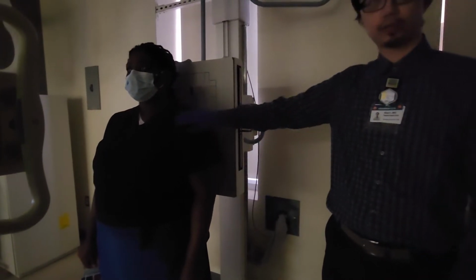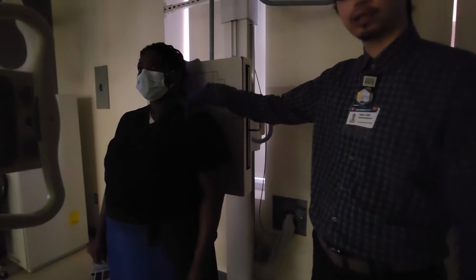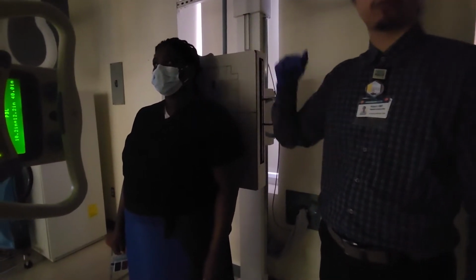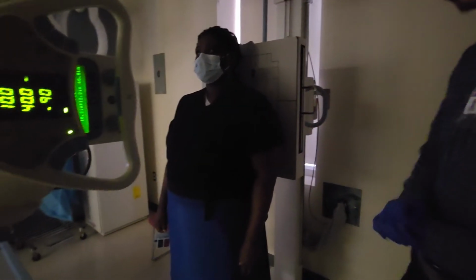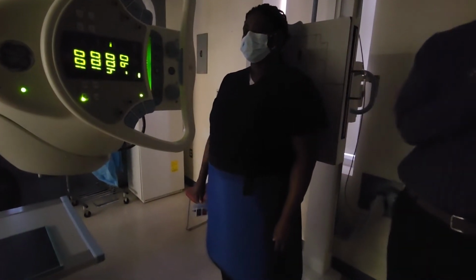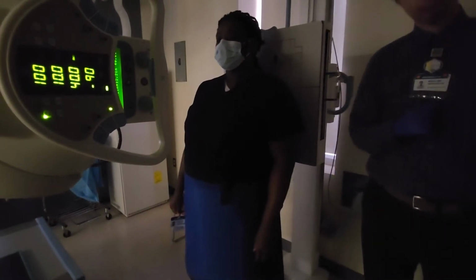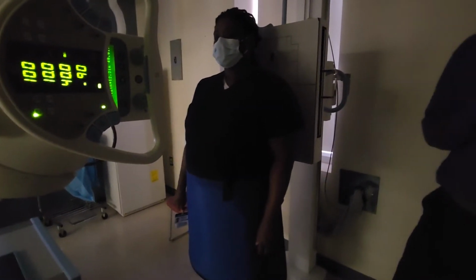If you are able to find the coracoid, our shoulder centering is going to be 1 inch inferior from the coracoid. But what if you can't find a coracoid? What if you're trying and you just cannot find a coracoid? There is something else you can do.